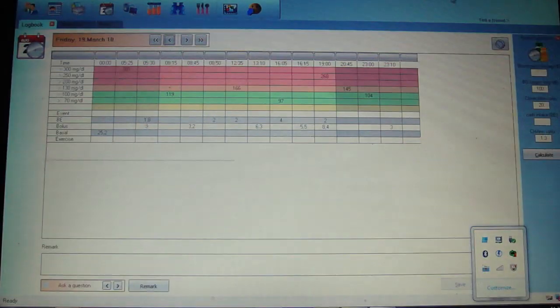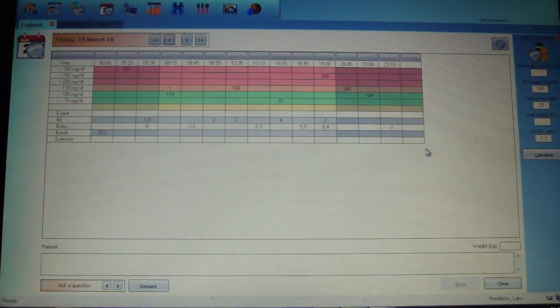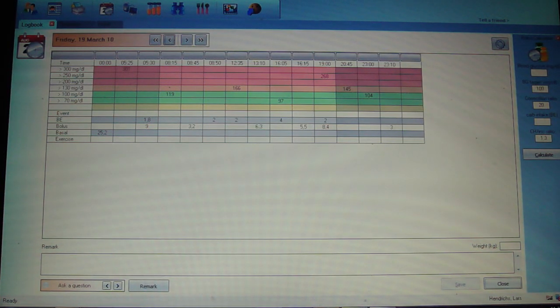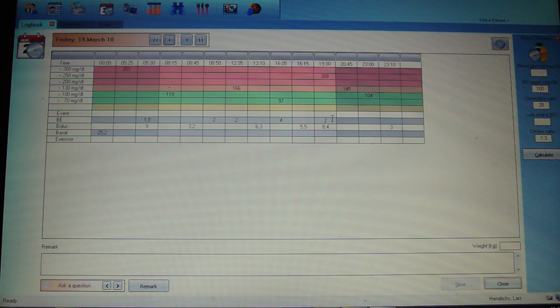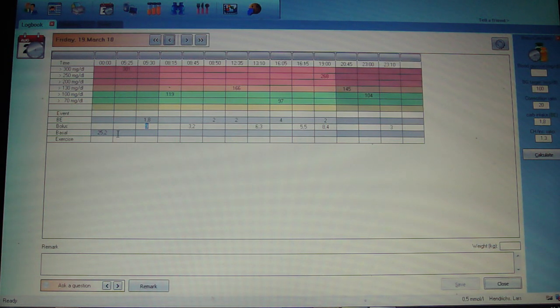Here you can see the PC version of the tool. You can see values from yesterday: your blood sugar values, the BEs you have eaten, the bolus value for the whole day, and the basal rate that was read out from the pump.